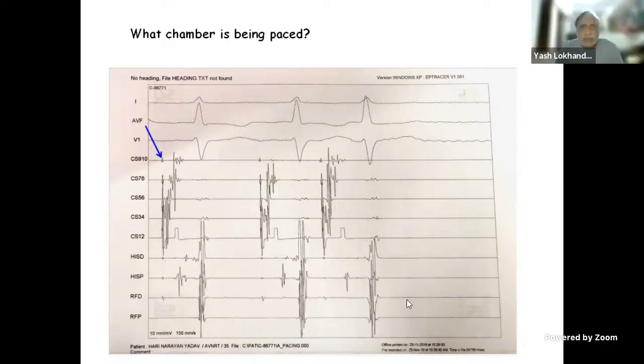Also, because it's a very fast speed ECG, the P wave gets stretched out, so you may not see a proper P wave. So don't be misguided by not seeing a P wave.